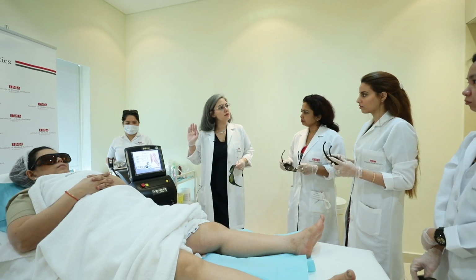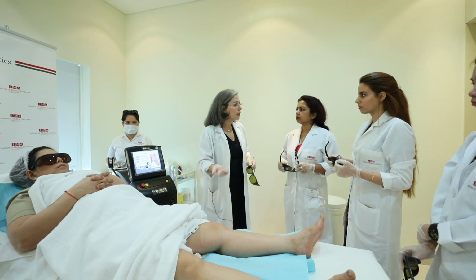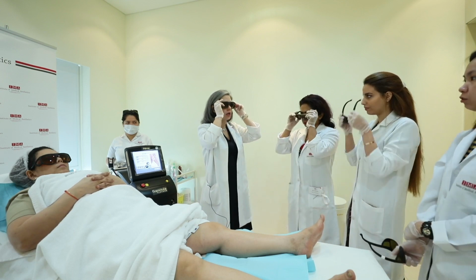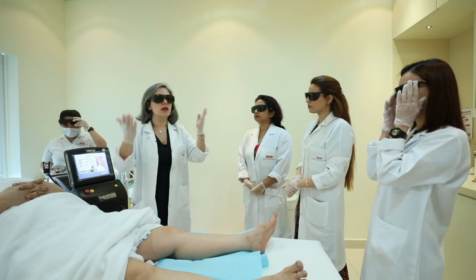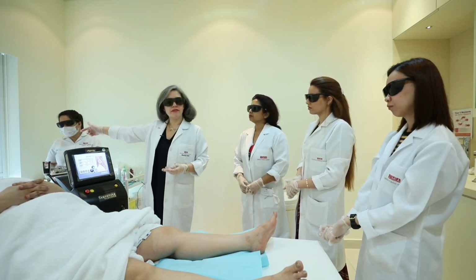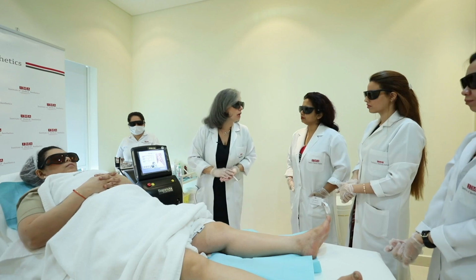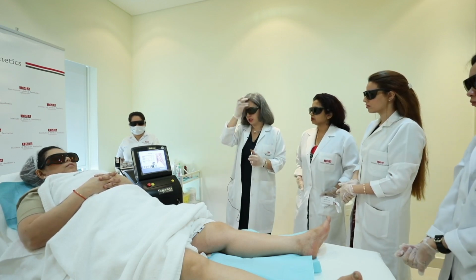What else in terms of safety do we have to consider? Here is actually our nominal hazard zone. What is the consideration in the nominal hazard zone? Glasses on. So you will pick your glasses in LTCA and wear them when you are in the nominal hazard zone. Now that we have a window in the nominal hazard zone, the window should be covered because we are using hair removal. You know that hair removal lasers are the most dangerous.